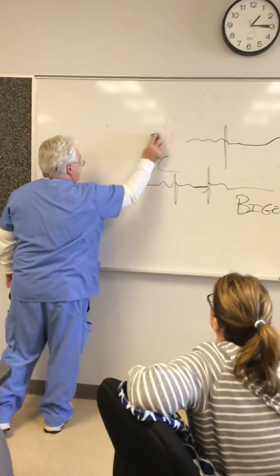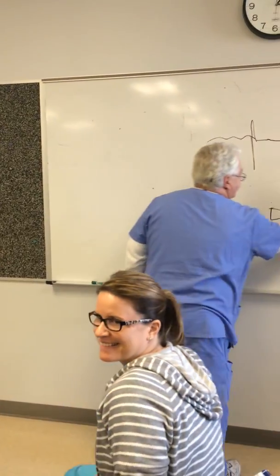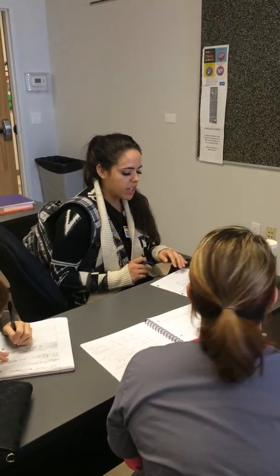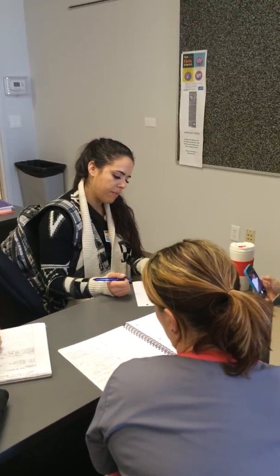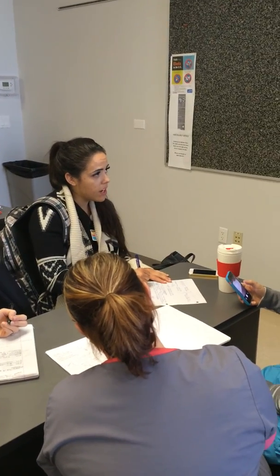So the thing that you're going to see about the PAC or PJC is you're going to have a regular rhythm and then you're going to have somewhere irregular. You're going to have a regularly irregular rhythm. What's the P stand for in all those ectopic beats? Premature. So, can you have a premature beat and a regular rhythm? Right. No.